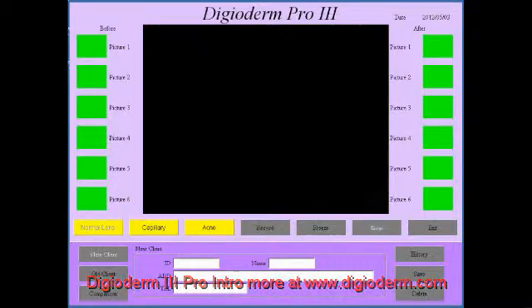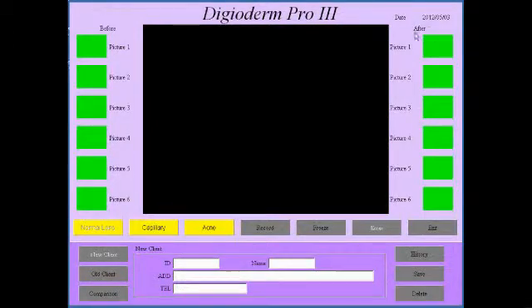This is the software here — you can see it's the Digioderm Pro 3. Now to take a picture you simply click on whatever spot you want to reserve for the picture, you freeze the image and click enter, and that brings up that image. You can take images before and after — it's not essential, but that's if you want to do image comparison, which the software allows as well.